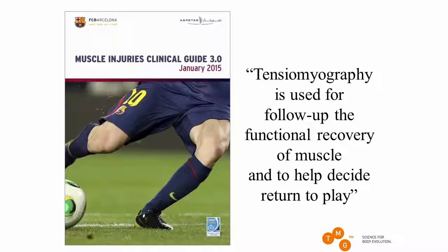Okay, this is just one part of the muscle injuries clinical guide that was written by these two institutions. Yeah, you can get it there. This is just to prove the last thing I showed you, so you can use it as a functional test when deciding if the subject is ready to return to play. So the tensiomyography is positioned in the second part or the last part of the rehabilitation process.